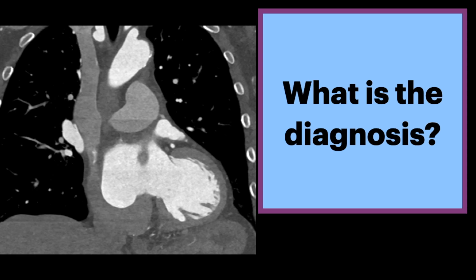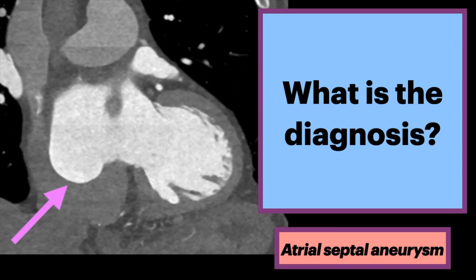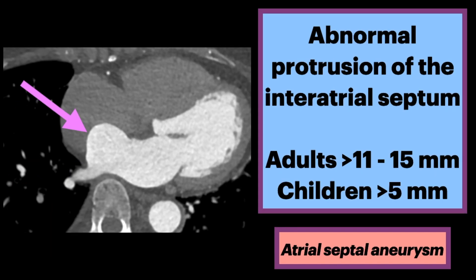What is the diagnosis? This is an atrial septal aneurysm, also known as an interatrial septal aneurysm. It is defined as an abnormal protrusion of the interatrial septum.